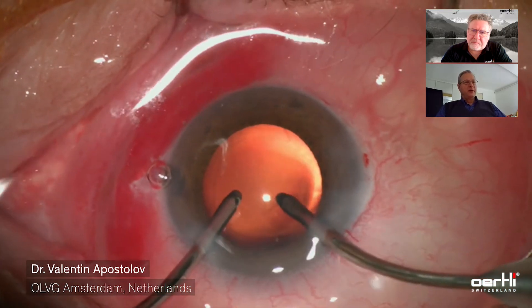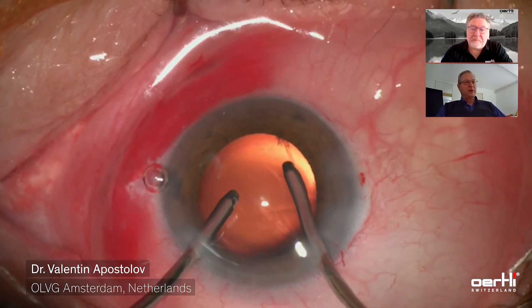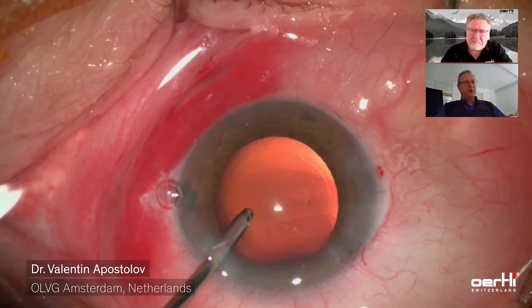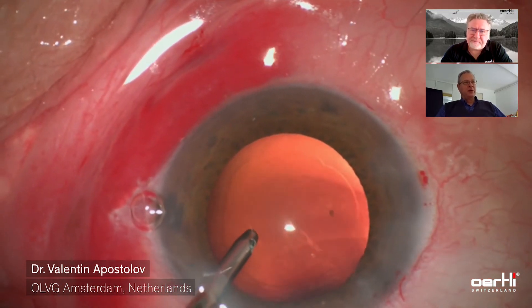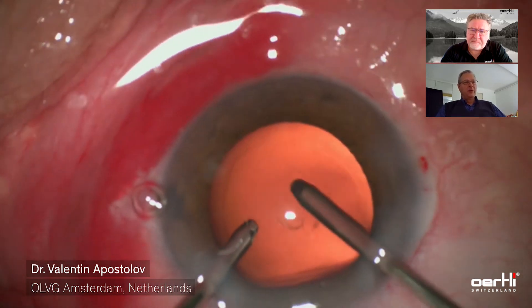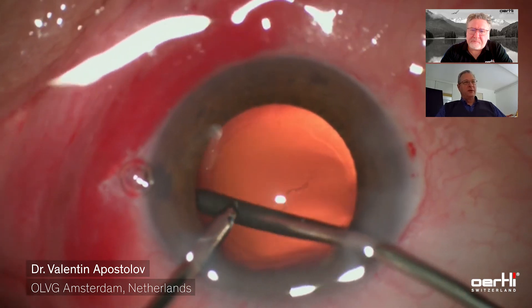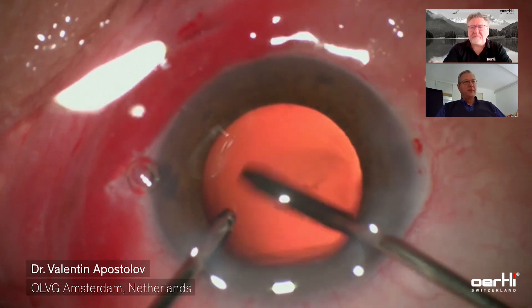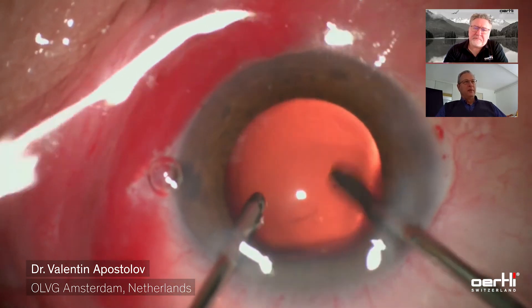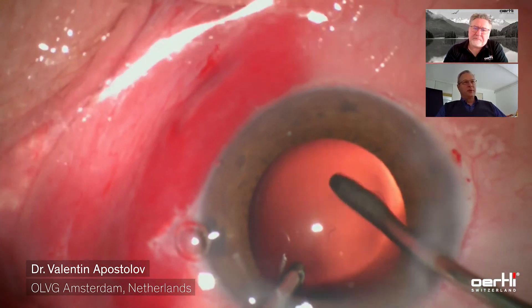Now the cortex has been removed and I'm switching to polishing mode, with the opening of the irrigation tip pointing towards the capsule. With a very low vacuum — something like 8 or 10 mmHg — I like to polish all the central part, at least, of the posterior capsule.